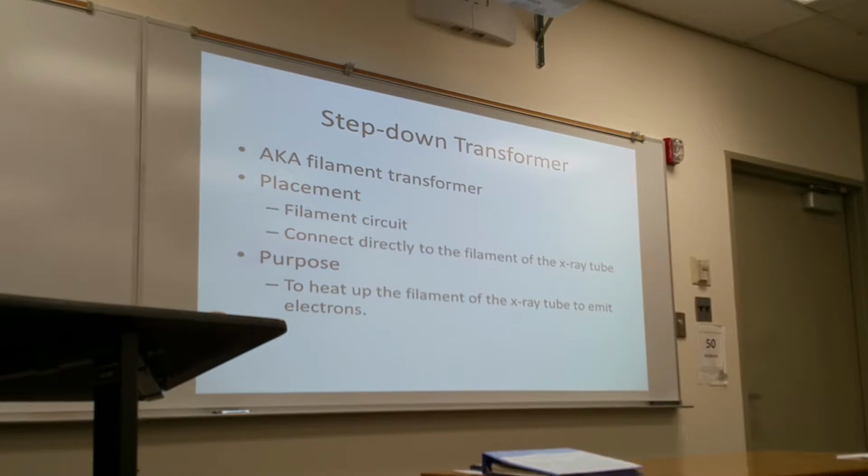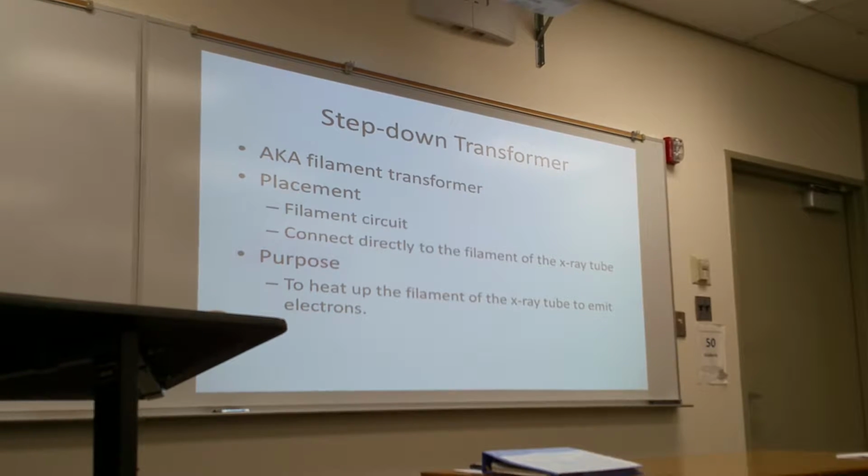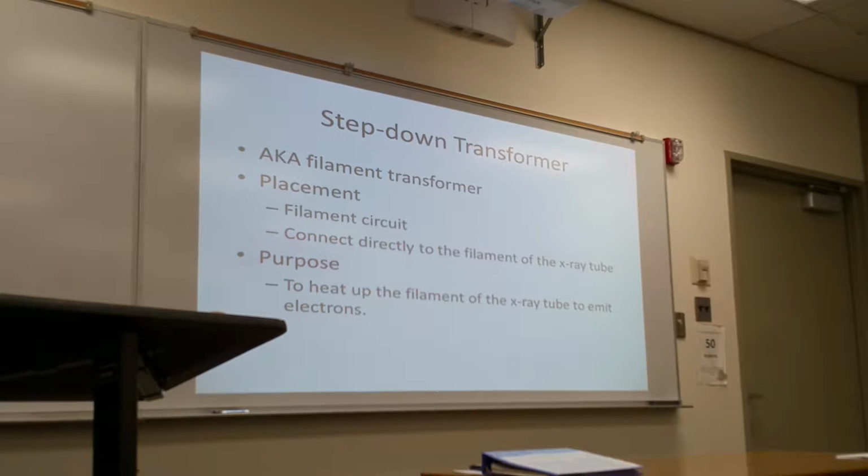Step-down transformer, also known as filament transformer, is located in the filament circuit.